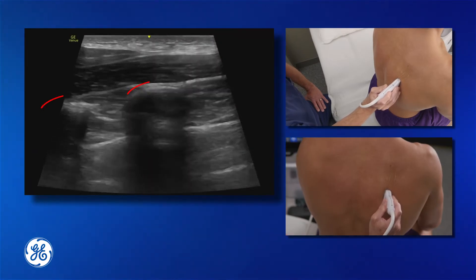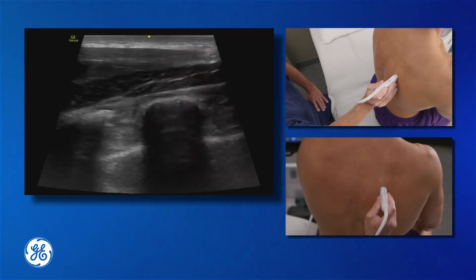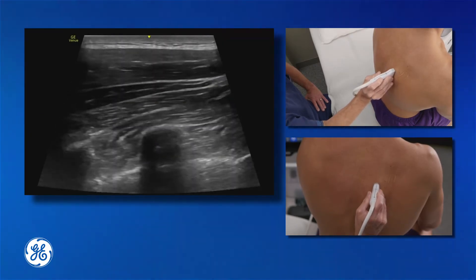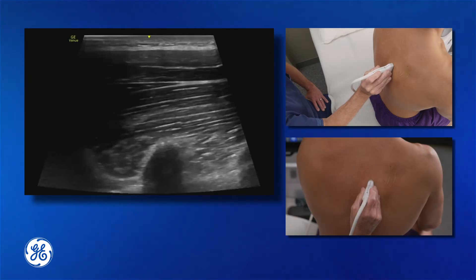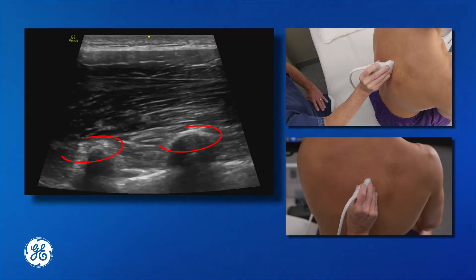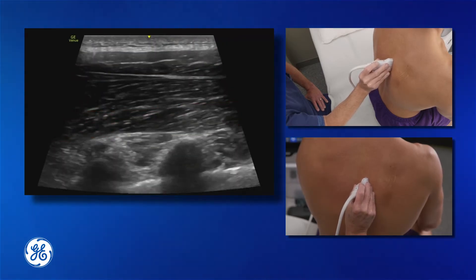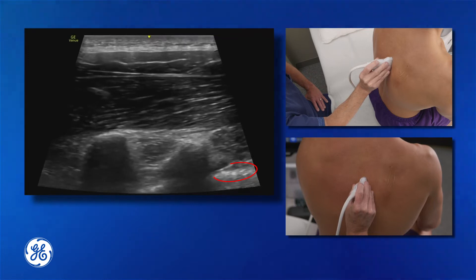We can see our rib here — it's a rounded structure. We're going to scan medially and see where those ribs level out into a transverse process. And we're going to look for our three muscle layers of trapezius, rhomboid, and erector spinae. We can see our pleura moving freely down below.